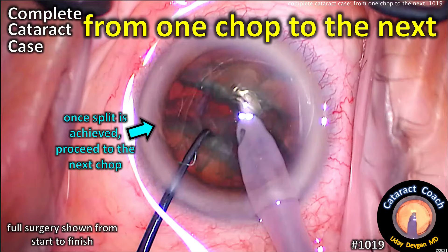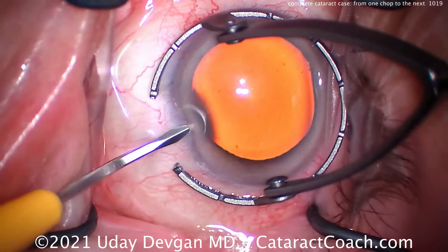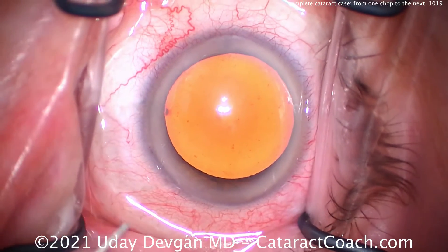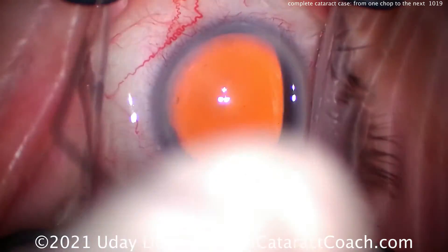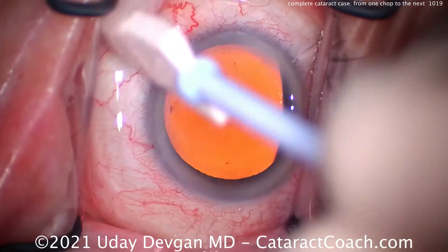CataractCoach.com — a complete cataract case from one chop to the next. This is the last of our series for this week of complete cataract cases, showing the whole case from start to finish. I think it's very useful. These are all surgeries that I did on the very same day in our surgery center, and there's a lot to be learned here.